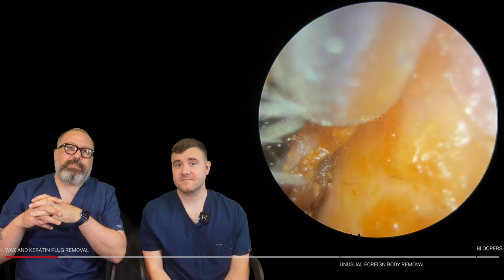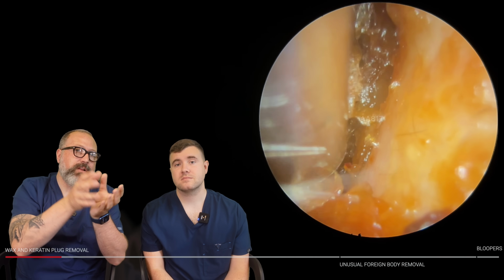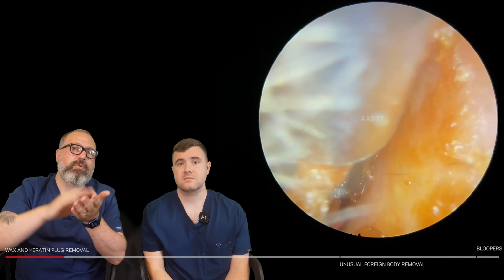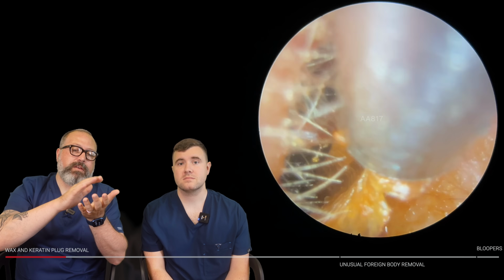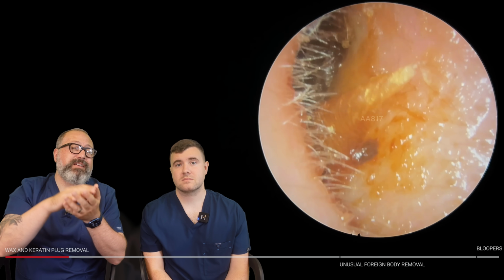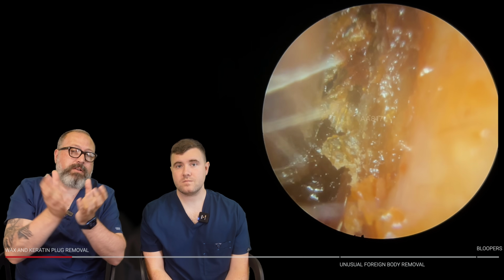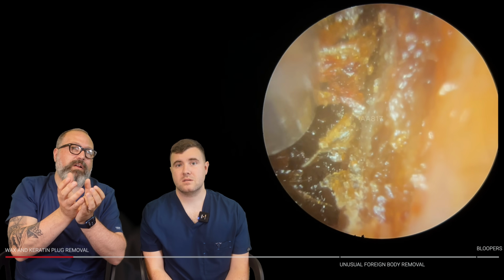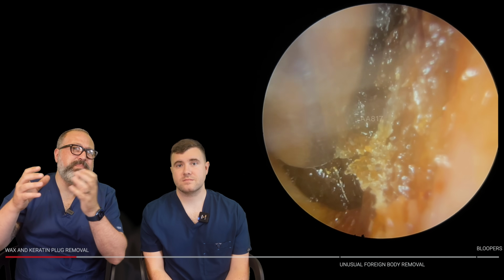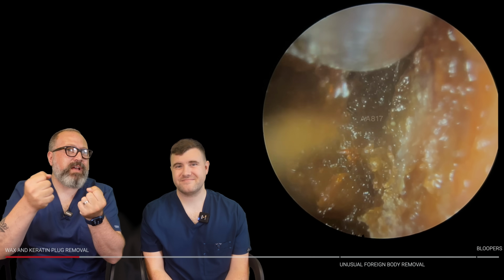Oh, well. So you can see this long strip of skin on the one side here. I'm just trying to pull this out. What's happening here is the skin's still attached to the canal wall. So this is just this very thin keratin layer that's come away from the canal wall. We've said before with the eardrum, the top epithelial layer forms the ear canal wall skin, and then as that migrates to the outer part of the ear canal, that skin cell starts to die, starts to fill with keratin, so starts to harden. So what we've got here is this hard section that's sitting around this softer plug on the inside. And it's a real difficult one to remove just because there's bits of this keratin skin interwoven into the plug as well. So when you get a grip, it doesn't want to come away. That keratin's holding it together.